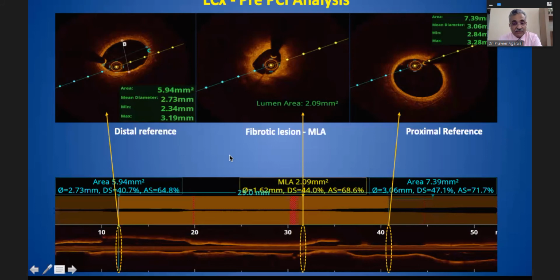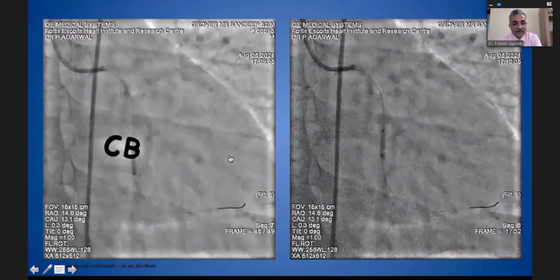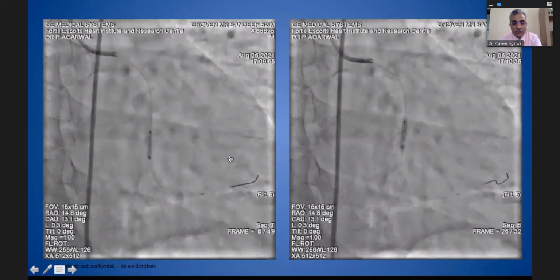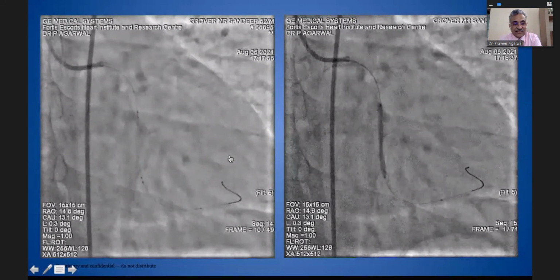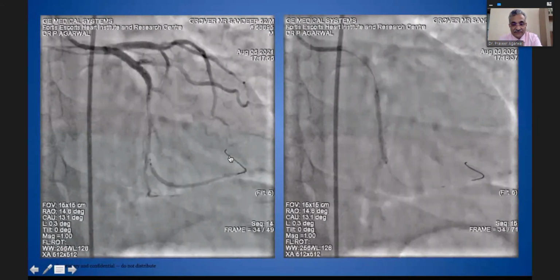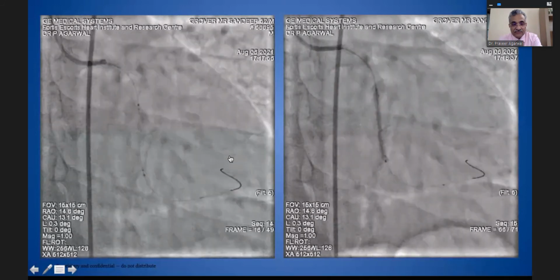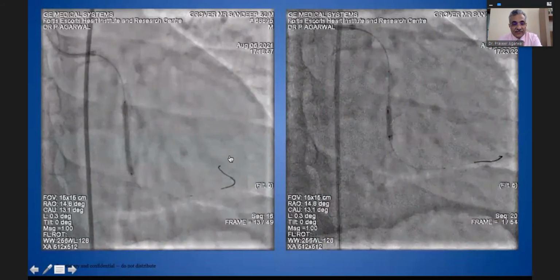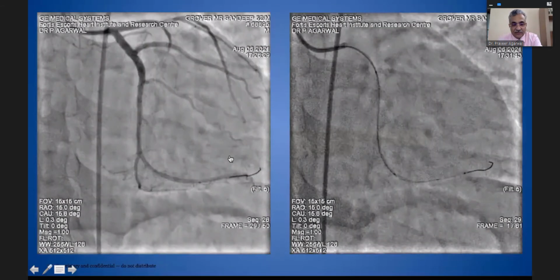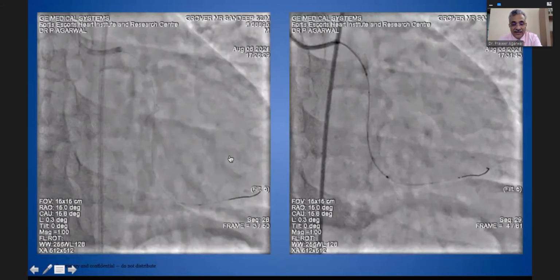They look simple, but they are not. Now see, it's a 2.5 cutting balloon at high pressure. High pressure means about 16 or 18 atmospheres to make a good room there. And the 2.75 scaffold, because this comes in a minimum of 2.75, deployed at nominal pressures. Now it's the same 2.75 balloon at high pressures, about say 23 or 25 atmospheres, and an OCT run.